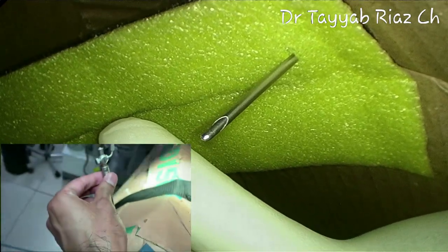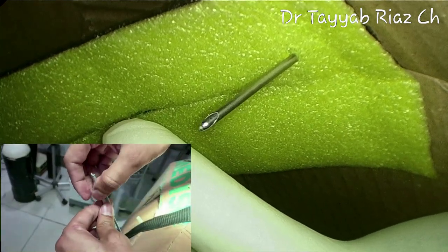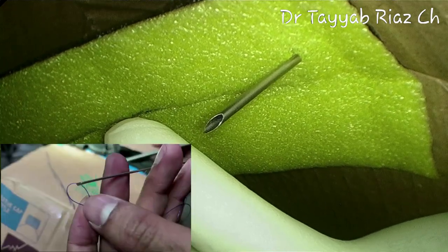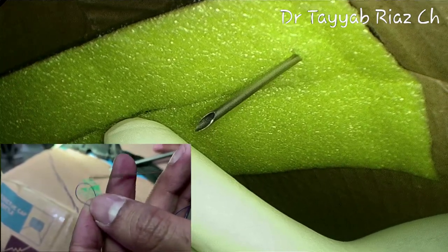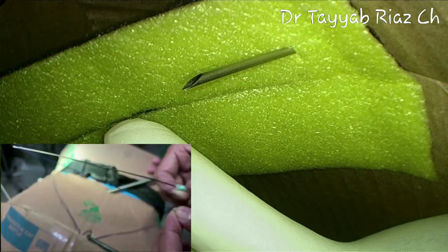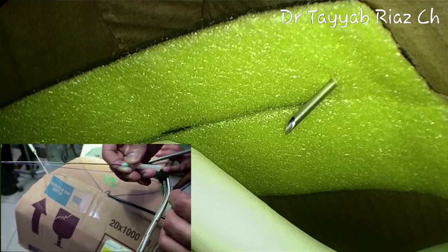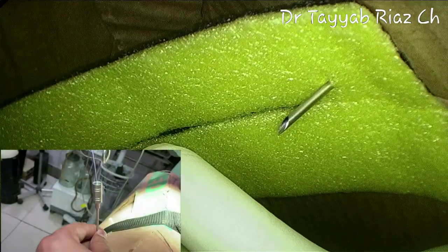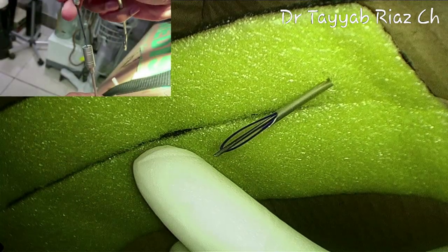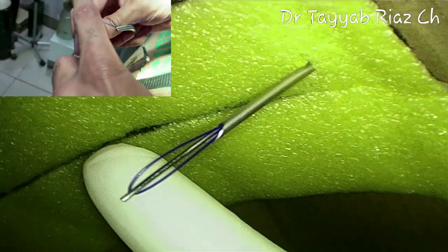After passing the Veress needle, I am removing the inner stylet part of the Veress needle out, and then, as I previously showed you, take a loop and feed it to the groove end of this loop passer and grab it with some artery forceps for easy handling. Then insert this loop passer into the Veress needle until sufficient loop has reached inside the peritoneal cavity out of the lower end of the needle.